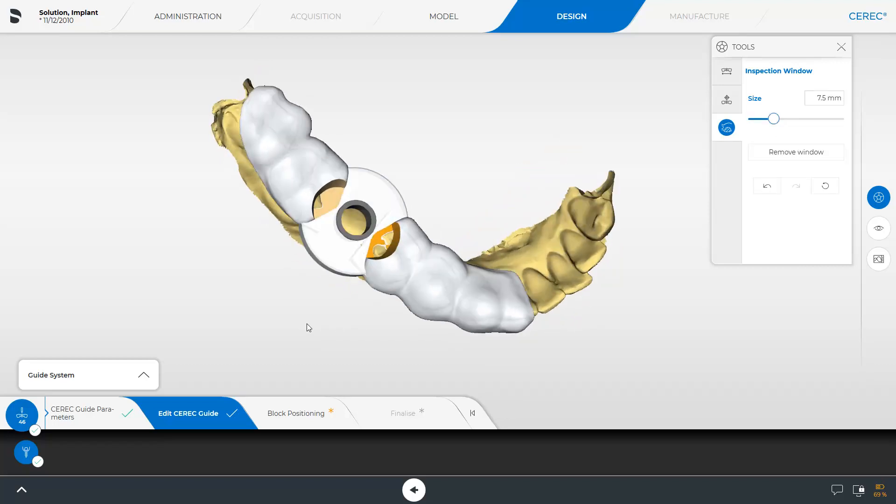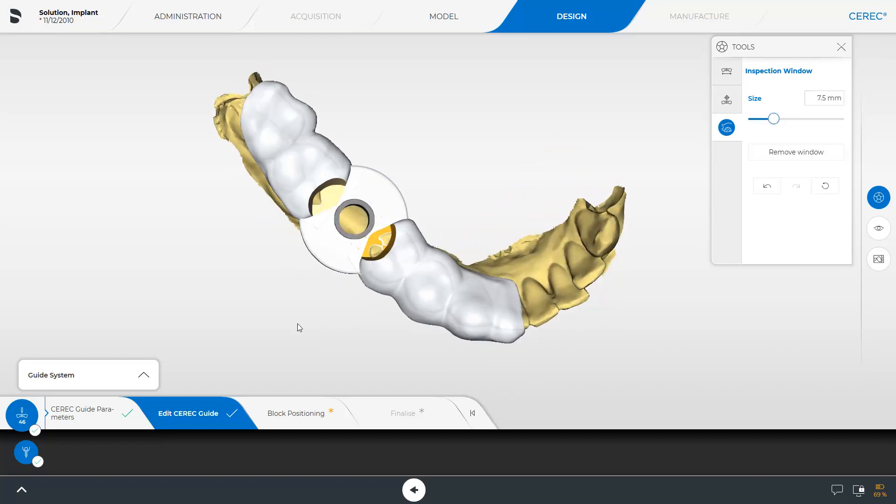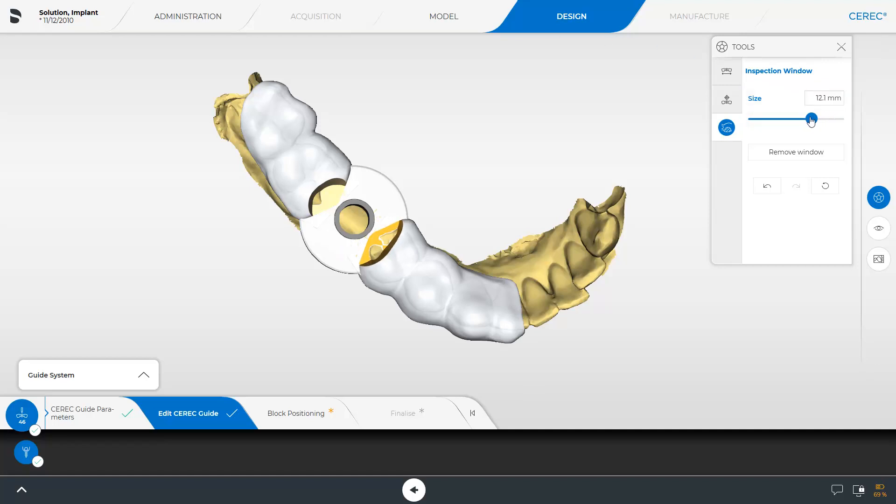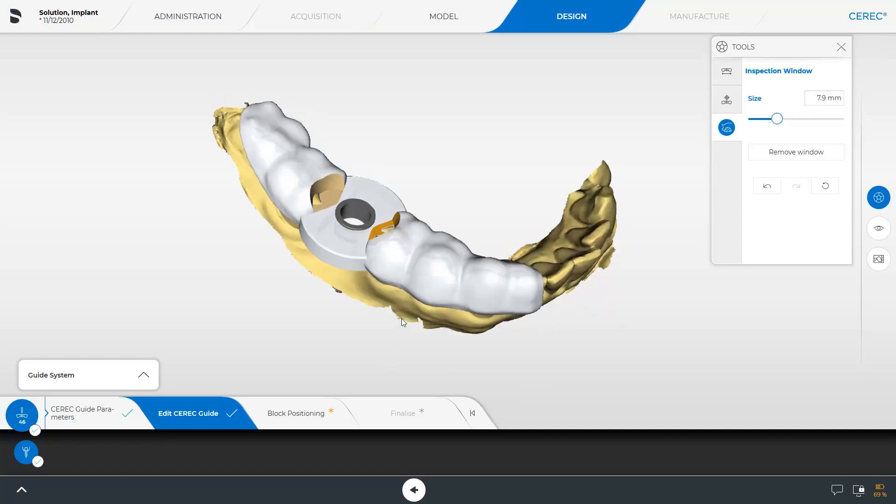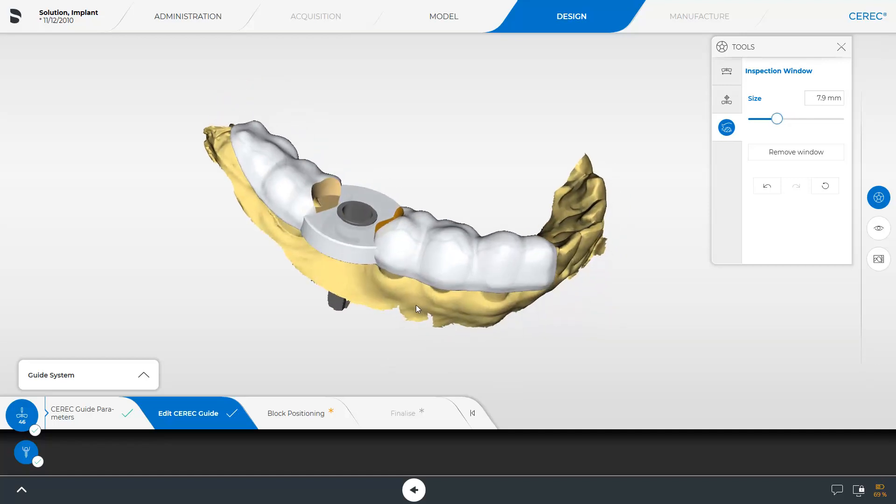This offers the additional advantage of improved sleeve positioning in narrow situations. The size of the inspection window can be adjusted with the slider. An additional window in the premolar area helps to verify the final seating of the surgical guide in the patient's mouth.